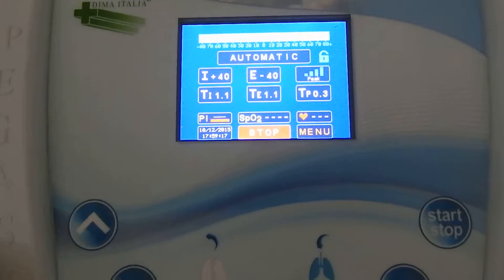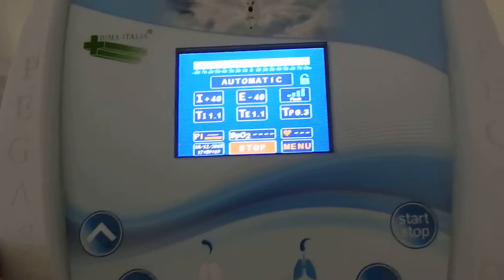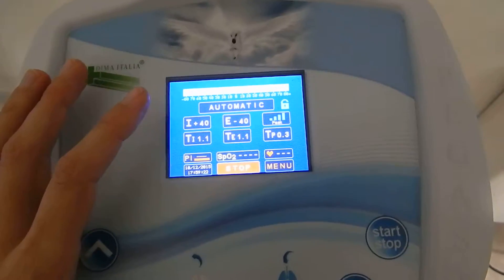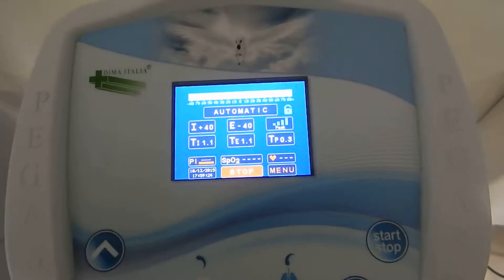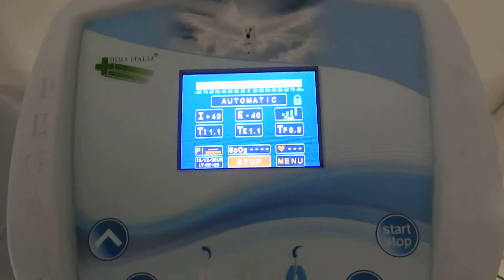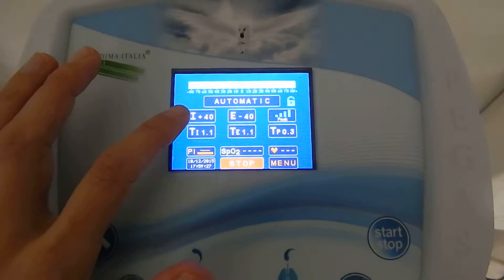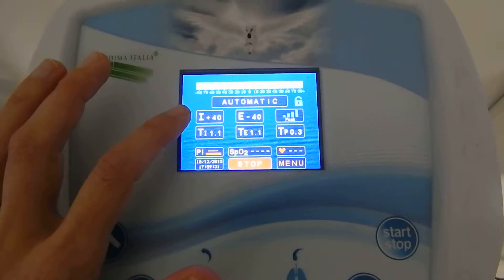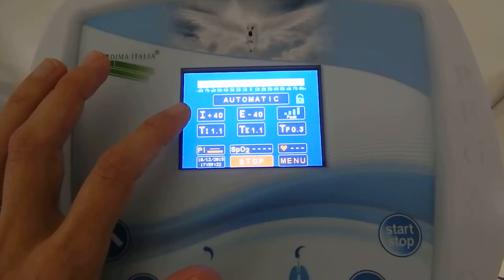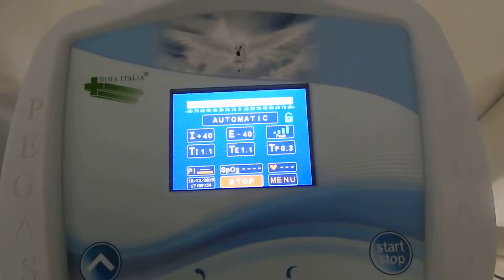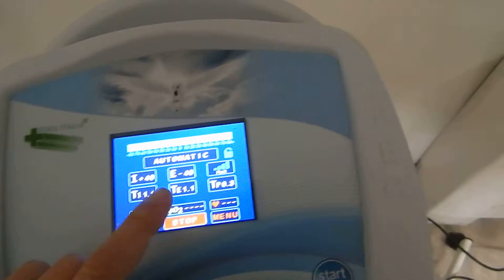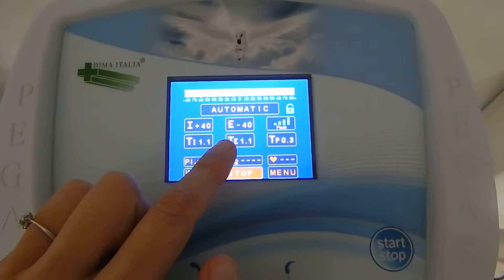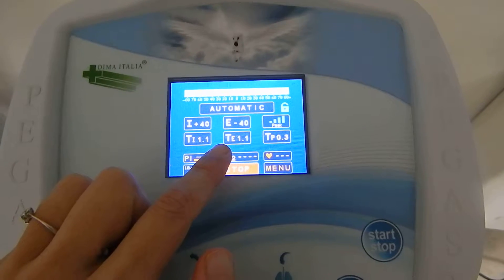With Automatic, the device automatically generates in-exsufflation cycles on the patient, delivering a positive inspiratory pressure which goes from 0 to 70 to inflate the lungs. Then it switches rapidly to a negative expiratory pressure which goes from 0 to minus 70, to deflate the lungs.